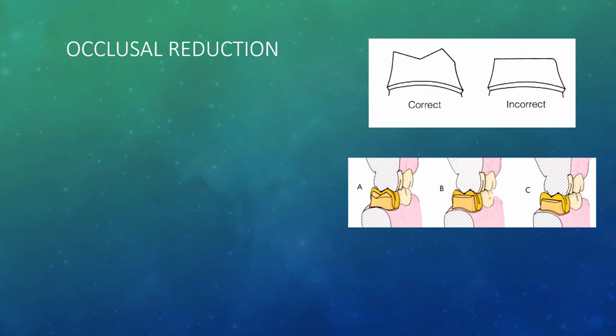So in that case, how do you handle it? When you're diagnosing and looking at the patient when he has walked into the OPD, you need to observe the anatomy of the tooth. If required, you will have to build up that tooth structure so that your preparation will also follow the anatomy and you will have an anatomical preparation. Only if you are able to do an anatomical preparation, your crown will restore the proper existing anatomy, and it will not just have a flat occlusal surface.